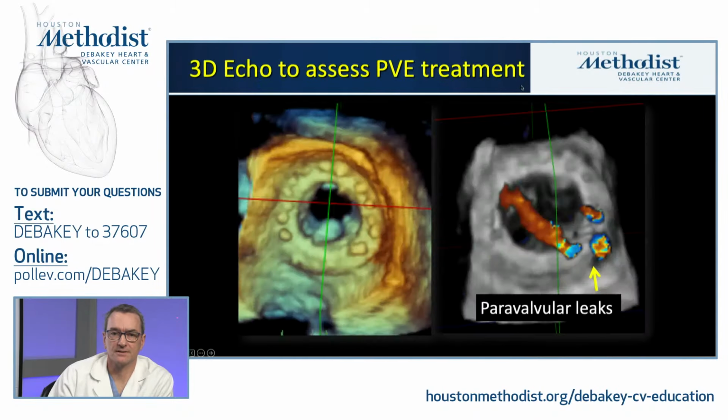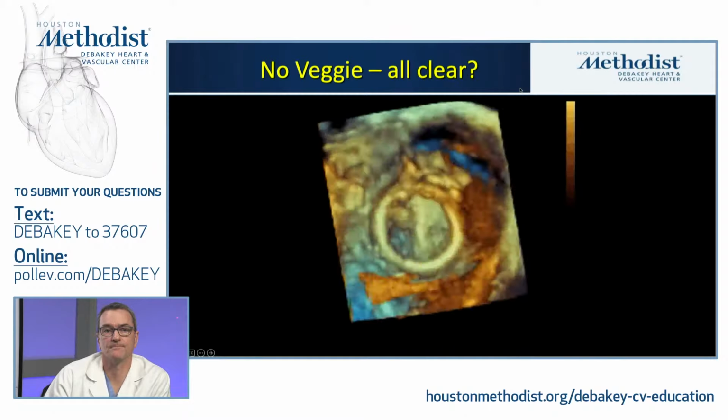So the endocarditis can manifest not just on the leaflets itself, but also anywhere in the surgical tissue around the valve. So these are 3 new paravalvular defects after relatively successful IV antibiotic therapy for bioprosthetic valve. So that's a very unusual course. Typically this would not have been this successful.